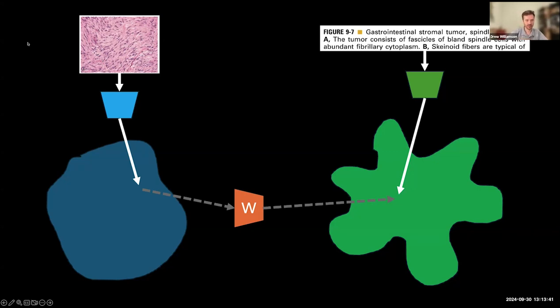So we take an image, we run it through our encoder, and we get some list of floating point numbers. And for the images, we might get 1,000 of those, and for the text, we might get 2,000 of those. And what we really need is some projector that takes a point in the image embedding space and converts it to the language embedding space. And because the ultimate idea here is to add these to a large language model and produce some language output.